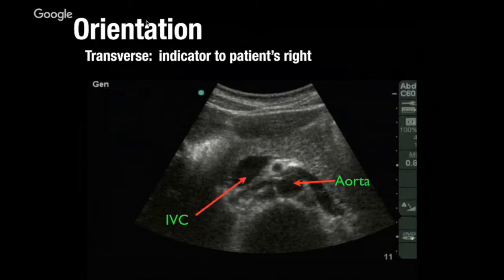So again, the language that we use is about the properties of the probe. It's about the properties of the tissue the probe is shooting through. It's about the properties of the sound. We're going to use terms to describe the picture that you're seeing in terms of some physics issues like anechoic, hyperechoic, hypoechoic, and we're going to talk about the orientation of your probe using transverse, longitudinal, using short axis and long axis of the organ.